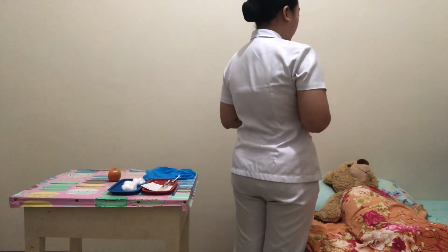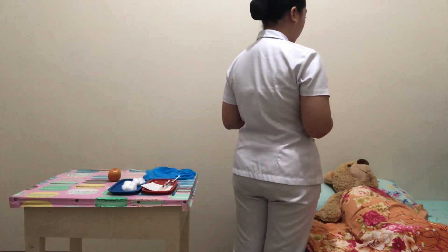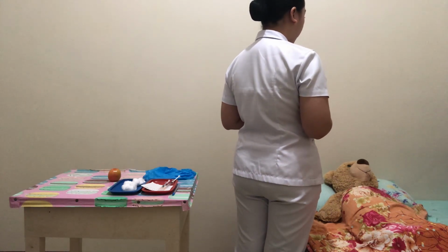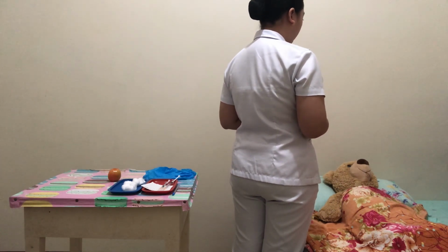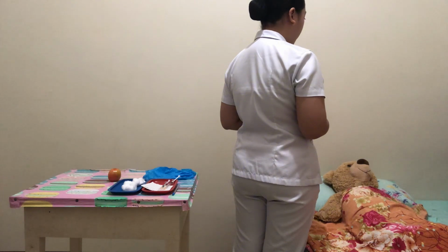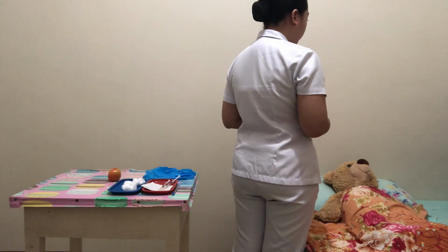Alright. Ma'am, today we will be doing the penicillin skin test. What I'm going to do is inject a small amount of the penicillin into your forearm to check if you're allergic to the medication or not. The medication will produce a small wheal that is called a bleb. A wheal is a small raised area like a blister. You might feel a slight prick as the needle enters your skin. So will that be alright?